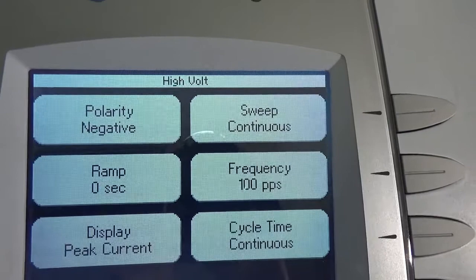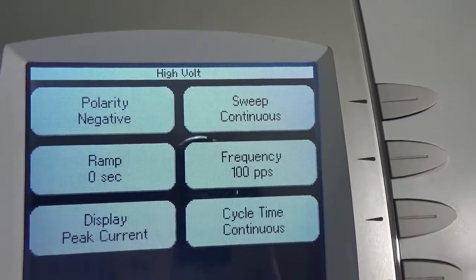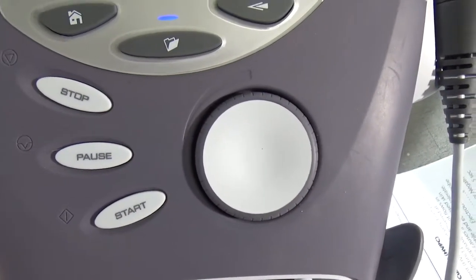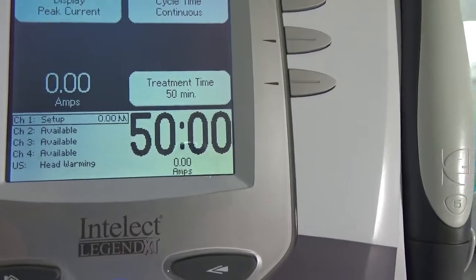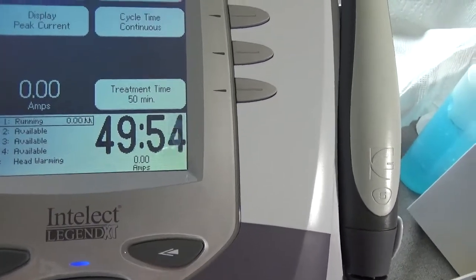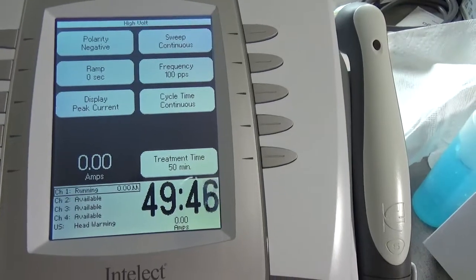The polarity is set to negative, and that is the active electrode that I have over the wound. You don't need a ramp for this because it's just going, and then when I go to hit start I will turn up the amps. If I hit start the time will start counting down. I can change amps to volts and turn them up.